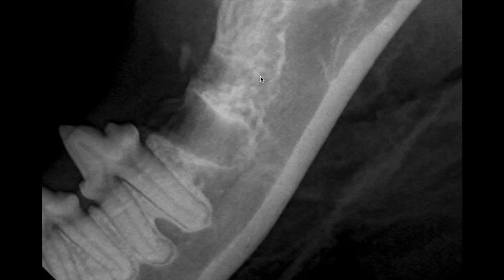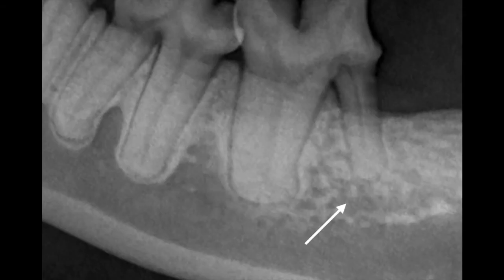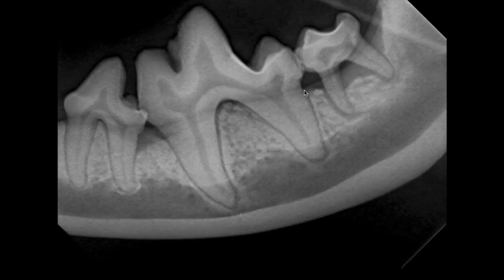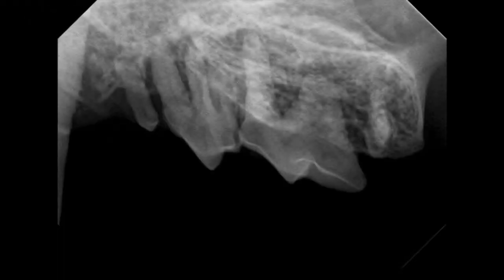What we do is go back and look at the radiograph that we took before. We don't have a lot of bone loss adjacent to the first molar, but we have significant bone loss here. We've got a wide periodontal ligament space here — look at that — and make the determination on whether that is the right or the left side of that patient.